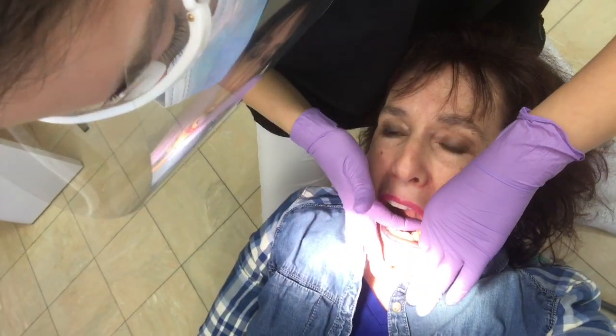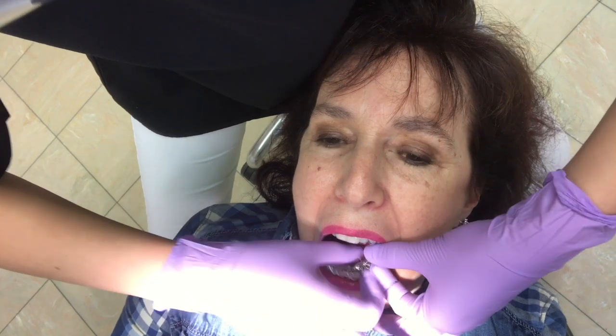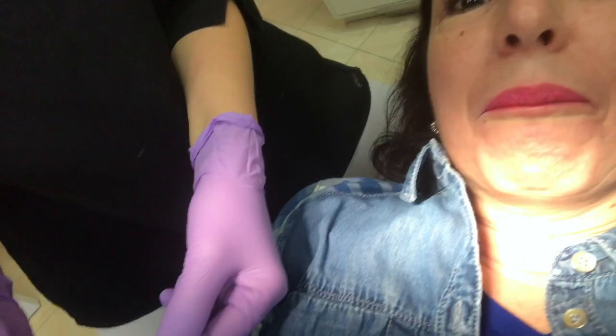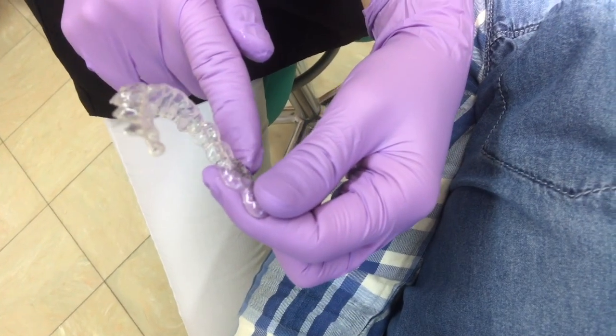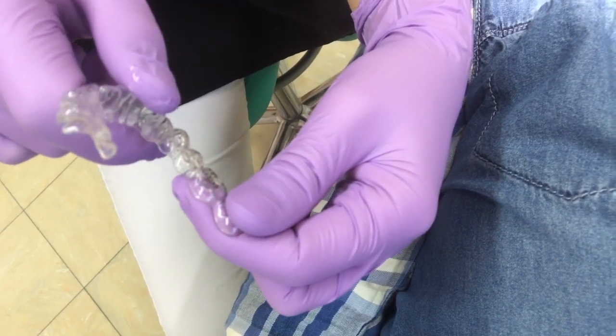So first I'm going to remove your lower aligner and I already can see the number. I don't know how you can film this but here you have an N and then you have the number. So it's correct — it's aligner number 10 that you have.